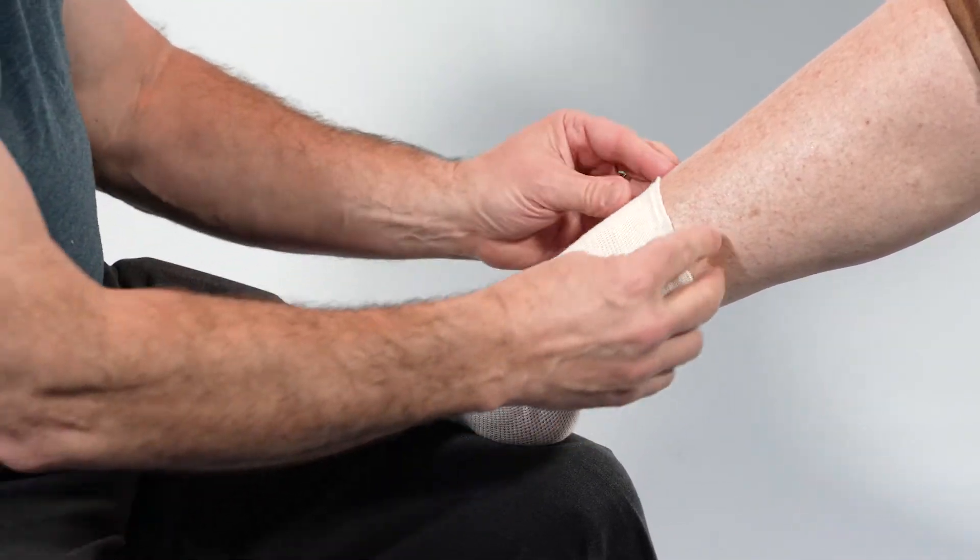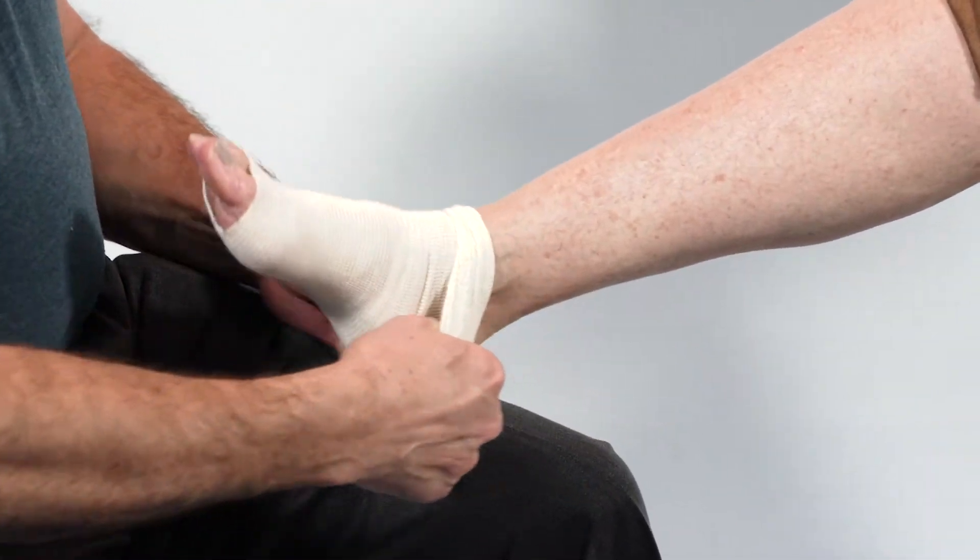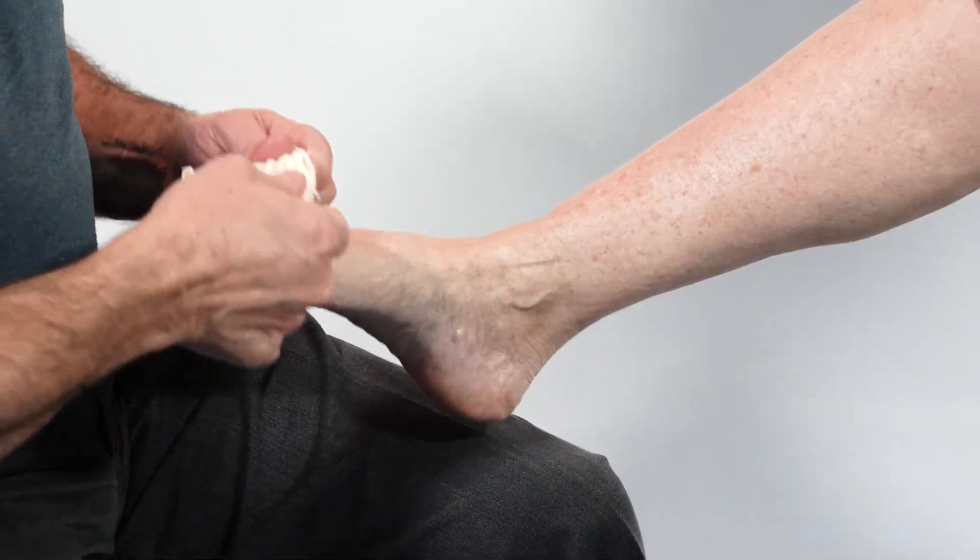This is usually accomplished by the clinician trying the size they feel is best to start with, and then adjusting up or down in size if needed.